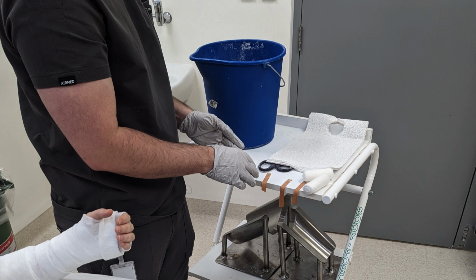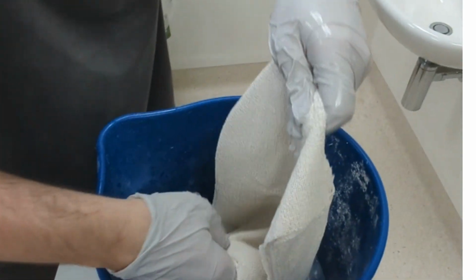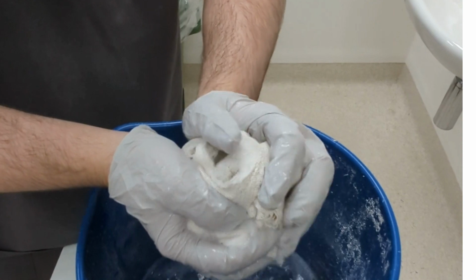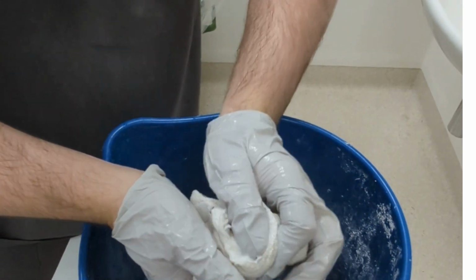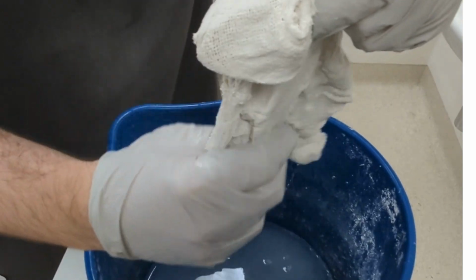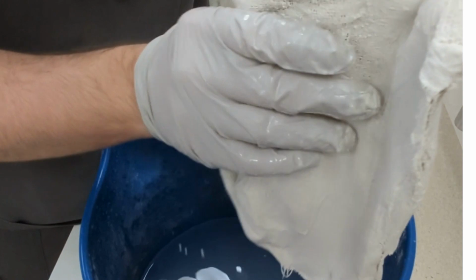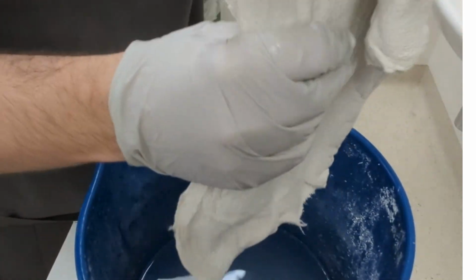Before continuing, it is important to ensure everything is within reach of the patient, as once the cast is wet, time is of the essence. Wet the plaster of Paris by submerging the entire product underwater in a bucket, ensuring the whole thing is wet. Wringing out any excess water is important to ensure the cast isn't too heavy or too wet. And then, straightening out the cast, ensure there's no wrinkles or folds before applying it to the patient.